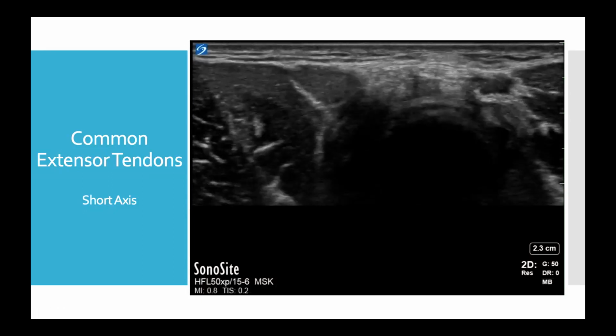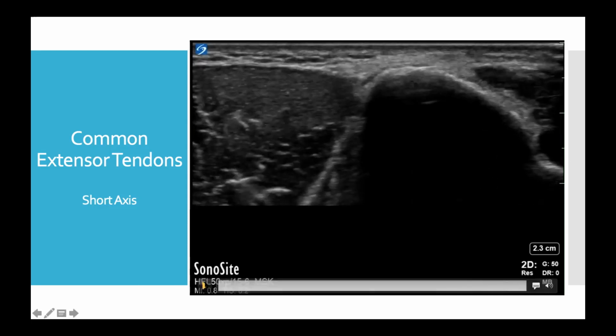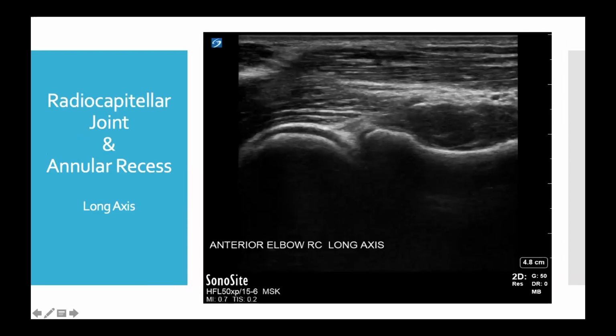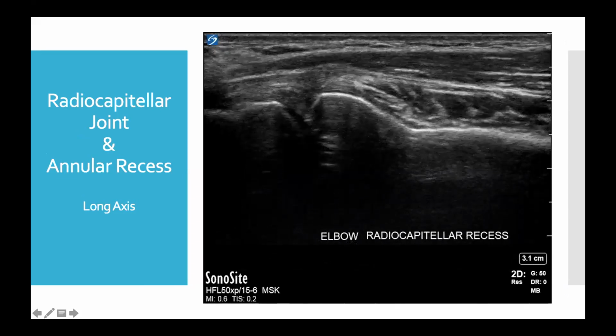Let's play through one more time. And we do want to include the imaging of the annular recess, which is adjacent to the radial head, just to make sure that we don't have any sort of effusion or hypoechoic signal there. We can see that coming down in this region here.